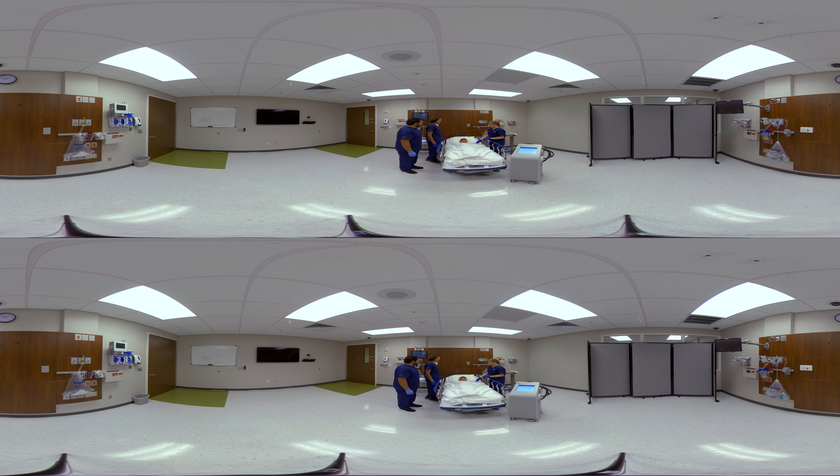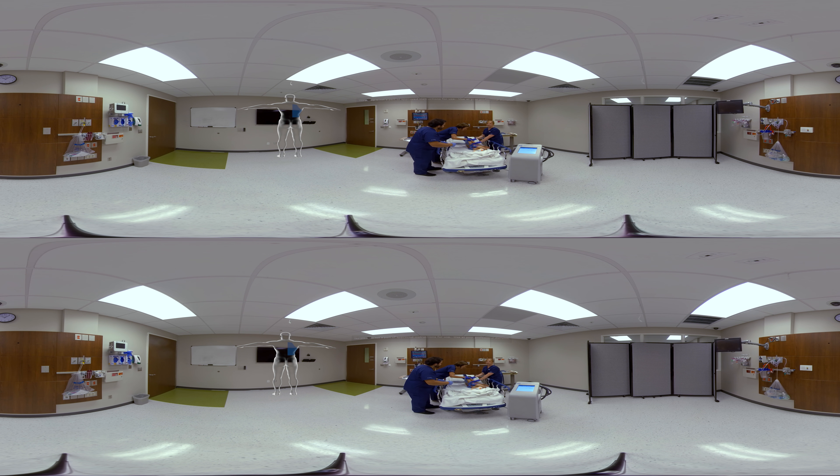First we'll go ahead and roll Cruz towards me in order to place the pads on the right side of his body. For the torso pad, you're going to locate the pad with the long straight edge and peel off the outer layer to expose the hydrogel. We're going to line up that long straight edge next to his spine, not on top of his spine — leave about a finger width distance from his spine. Then we can roll him over on his back and the pad will wrap across his abdomen.